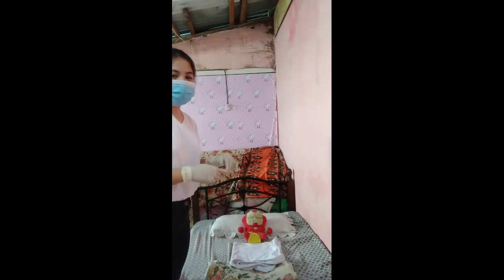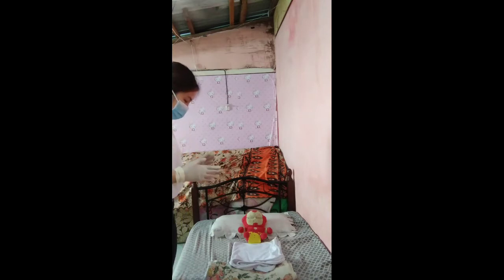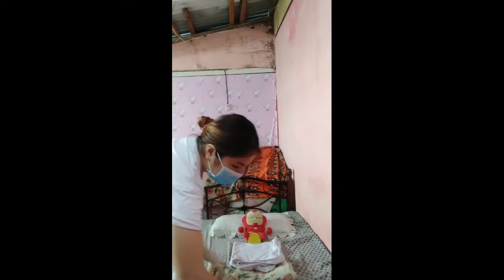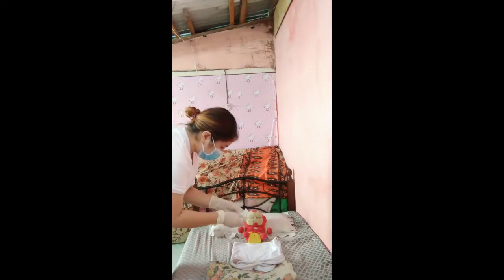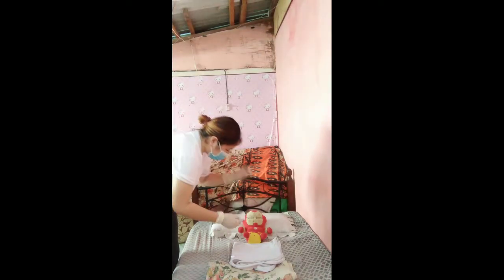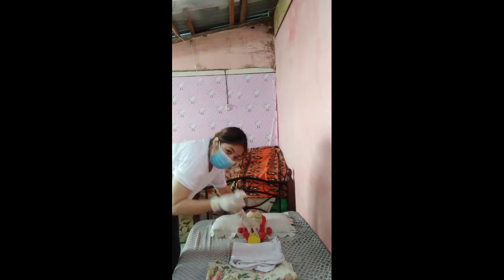After we inserted the 10 cc syringe into the port of the catheter and lubricated it, we need to clean the meatus of the patient. So we have here, we assume that this is an alcohol swab. So my non-dominant hand I am to put here on the meatus of the patient. So we need to clean the meatus.